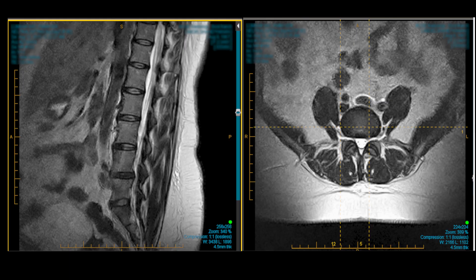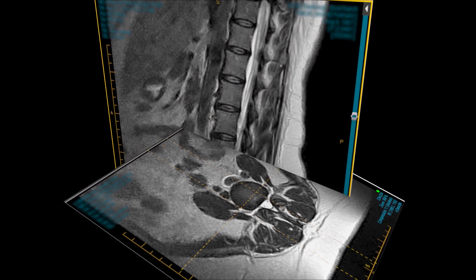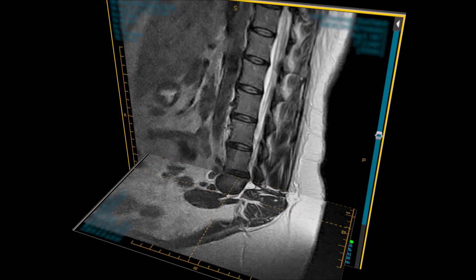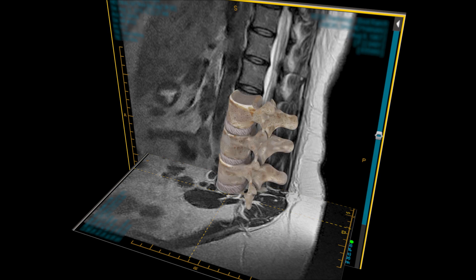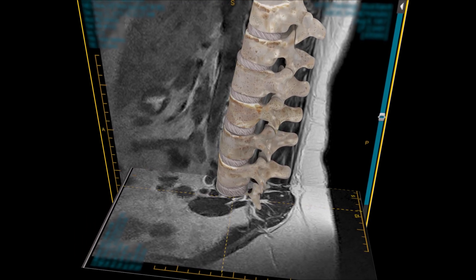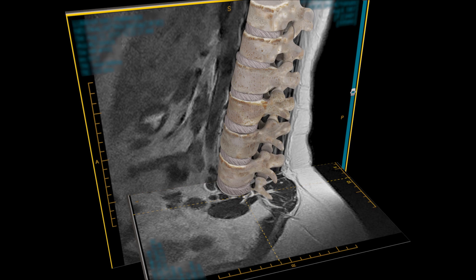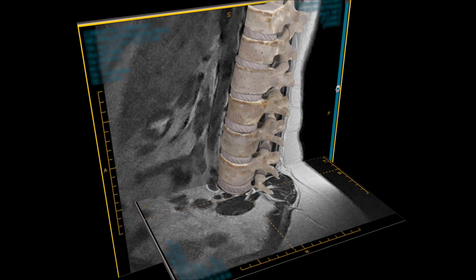To fast forward your understanding of the relationship between the axial and sagittal views, we'll superimpose the axial views onto the sagittal views and reconstruct the spinal anatomy. By doing this, we've accelerated your understanding of the relationship between these two views, and now you have a much better understanding of the anatomy of the spine, as well as how MRI studies can be used to identify specific parts of your spine.